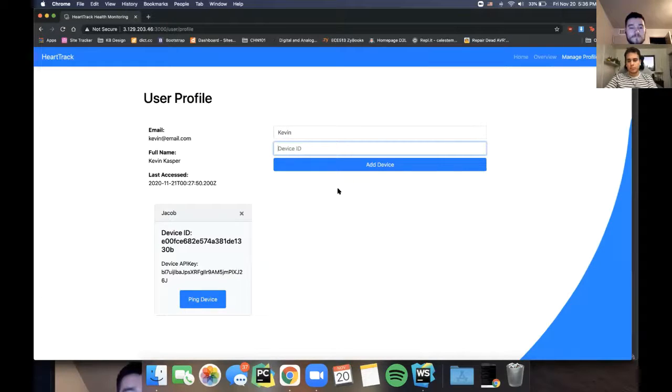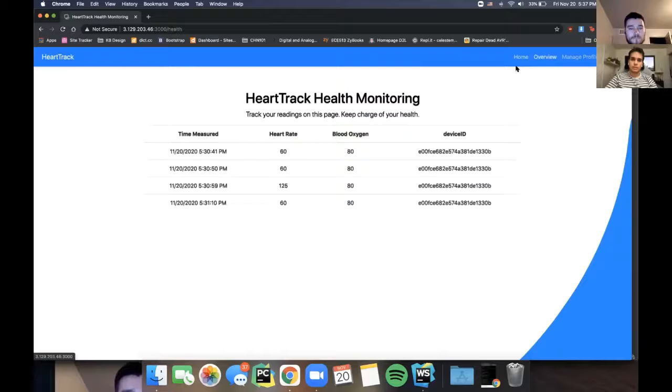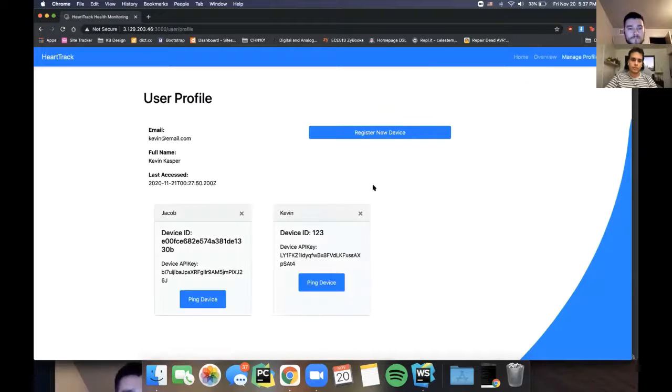Supposing at this point we only have one Argon functioning, so we will just add a fake device ID here and go ahead and add device. As you can see, it has created a new card. It has assigned it a new device API key and inserted the device ID. So we can go back to the overview page. There are no readings for it.